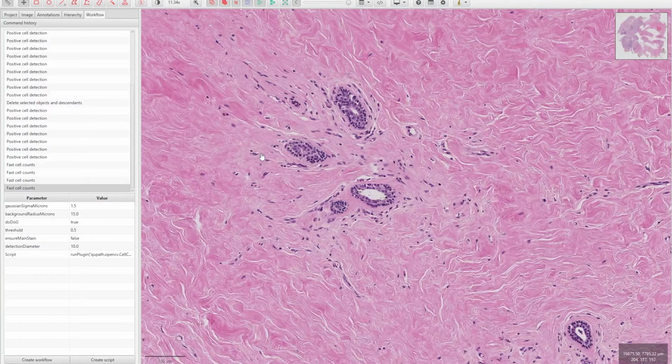By manually labeling representative regions, the tool learns to generalize these classifications across the entire slide, facilitating automated tissue segmentation and quantitative analysis. This is particularly useful for complex and heterogeneous samples where rule-based methods may fall short. So simply, this tool uses machine learning to automatically label pixels in an image based on user-defined tissue categories.